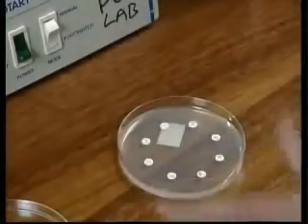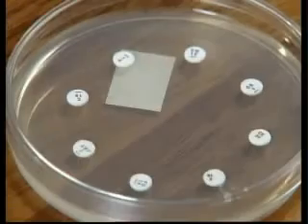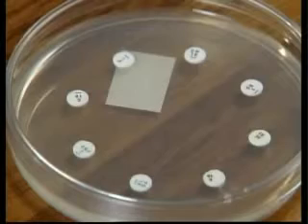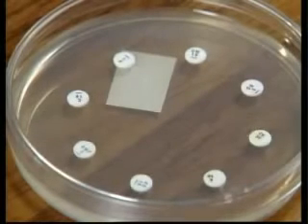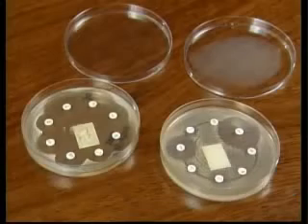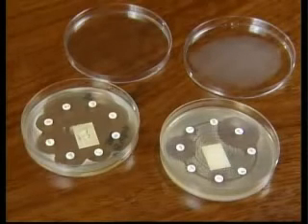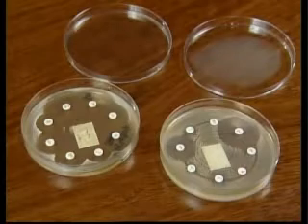The dispenser automatically dispenses discs onto the inoculated plate when the plunger is depressed. The ring of discs coincides with the silver ring on the rotary plater's turntable. The test on the left shows a strain that is fully sensitive to all of the antibiotics being tested. The plate on the right highlights a possible problem.